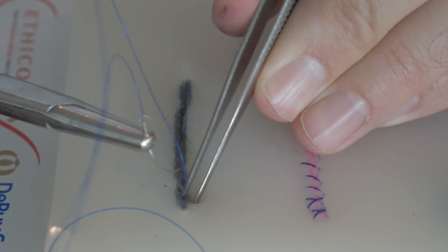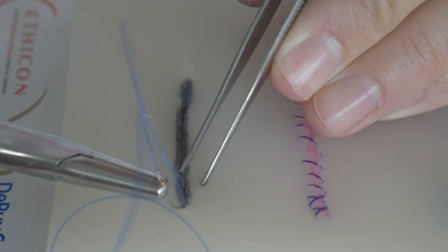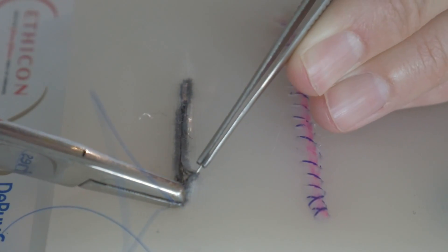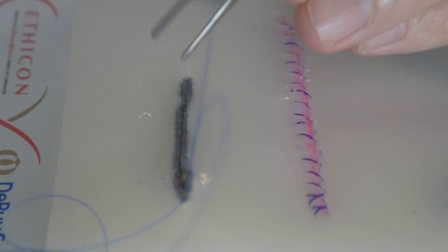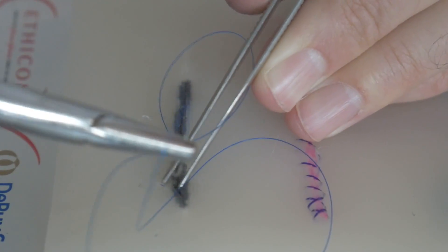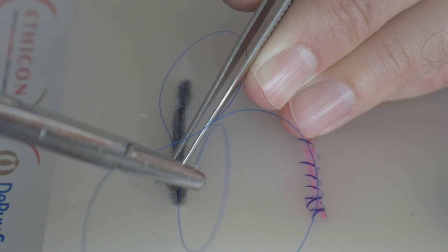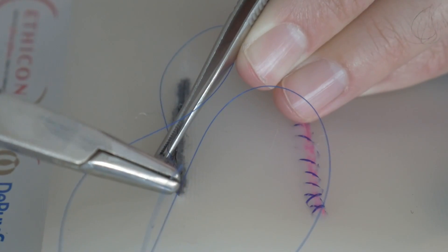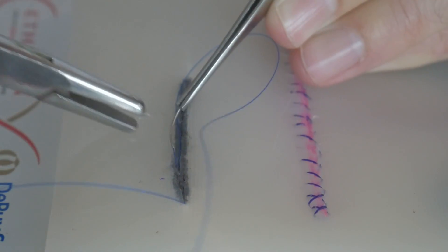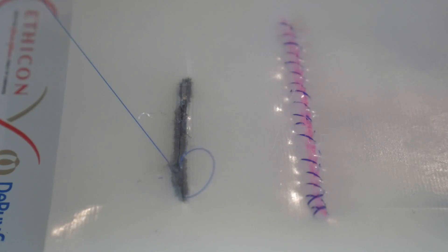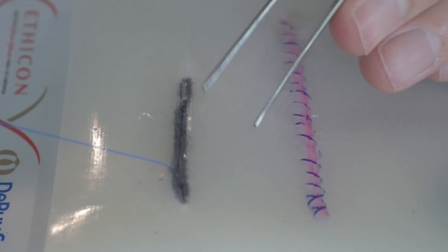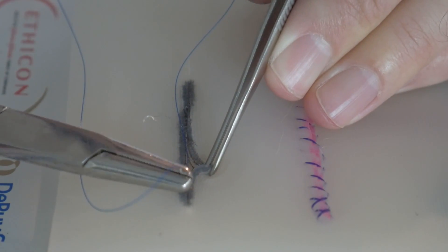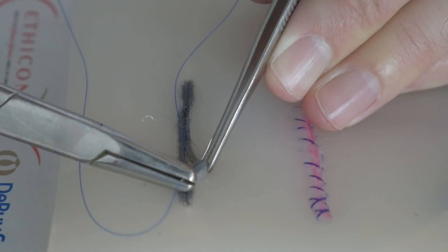Now it's important to note when you are doing a running subcuticular stitch that you really try hard to stay at the same level and the same layer. Don't go too deep. Don't go too superficial. If you go too superficial, the suture is going to be coming out of the skin. If you go too deep, you're going to have these weird kind of folds of the incision as you close it. And they're going to fold in on itself. So you really have to stay kind of at the same level and in the same layer as well as you can throughout the whole running continuous stitch.